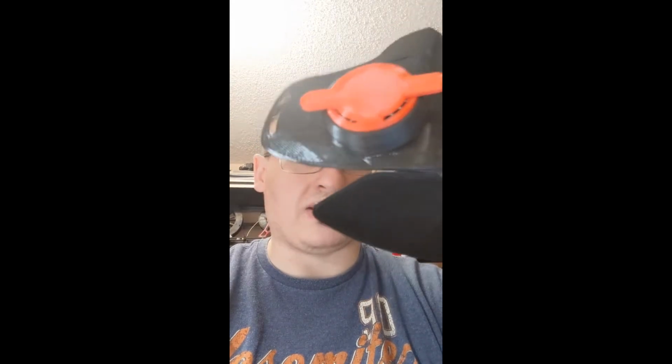if they want to continue peddling their Copper 3D filament as antimicrobial and medical use, that's fine, but they cannot keep using this mask as a way to sell their product. Because this mask just would not work by any standard at all.